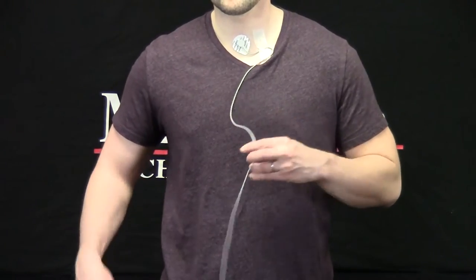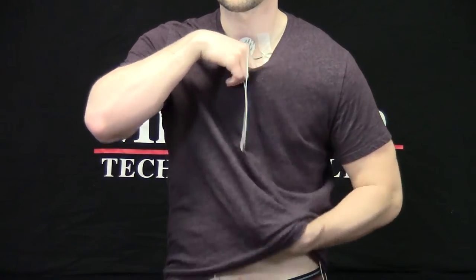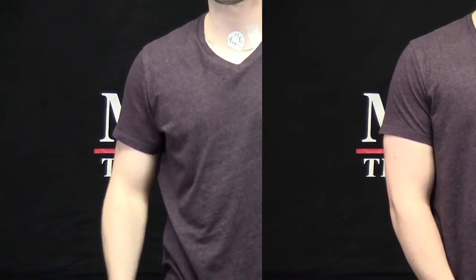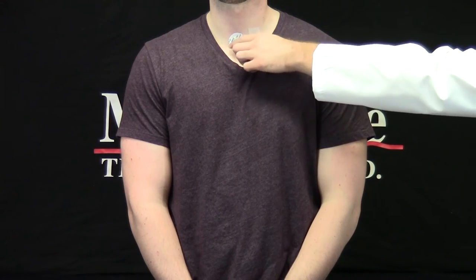I'm going to ask my subject to drop the lead wire down the shirt, as it's generally more comfortable for the subject to have the lead wire through the shirt as opposed to up and out of the collar. If your task involves a subject speaking, you may experience a lot of movement noise on the impedance channel if the electrode is placed on the neck. You can always move the electrode lower so that it is on the bone, or to either side.